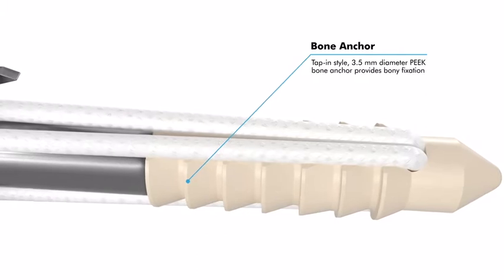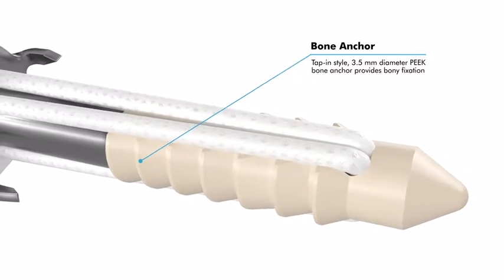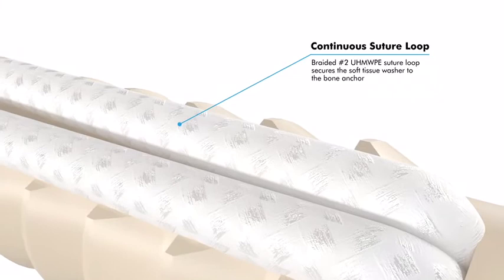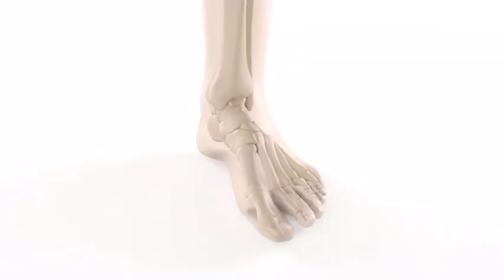The stainless steel washer significantly increases the resistance to soft tissue tear-through compared to conventional suture fixation methods. The continuous loop of two ultra-high molecular weight polyethylene suture connects the soft tissue washer and bone anchor, providing a secure connection resistant to gap formation.